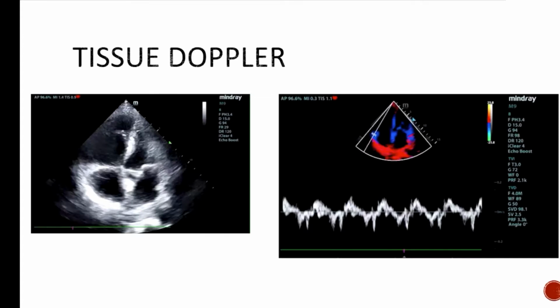So here we're doing something very similar. We're putting our pulse wave Doppler at the tricuspid annulus, the lateral wall, and then we're turning on our TDI, that's our tissue Doppler imaging. So you see this red and yellow screen, and that's showing you that the computer is kind of siphoning out the high velocity movements and just looking at those lower velocity, higher amplitude movements.